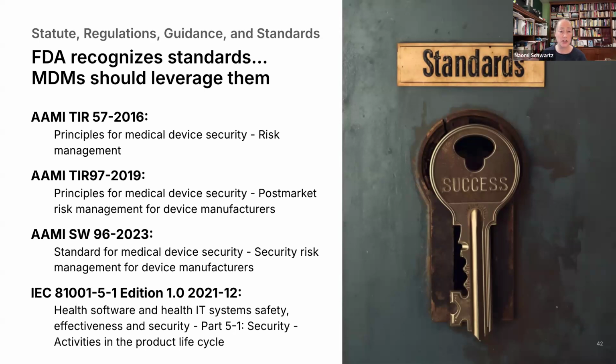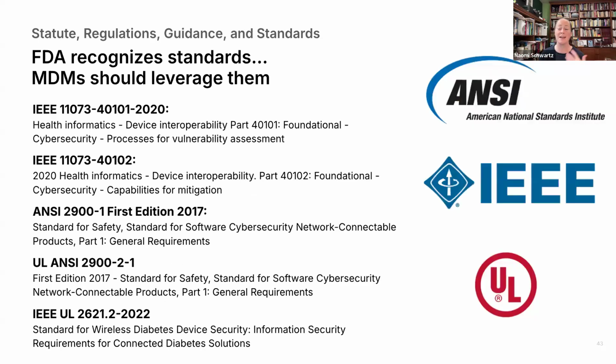And if you do leverage it with respect to the US, it makes things easier because the FDA reviewers actually know what this means. They understand it and they know the expected format for the information. So it's really useful to leverage them, even though it means you have to stay on top of a lot of different standards. There are other standards that are a little bit more complicated to figure out how to leverage, I think is the right way to put it.